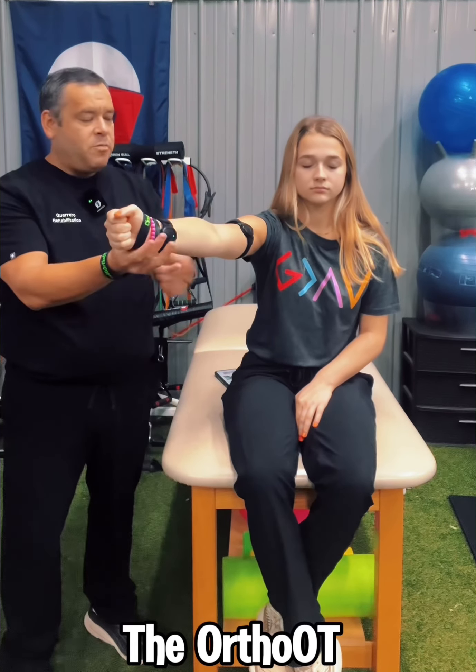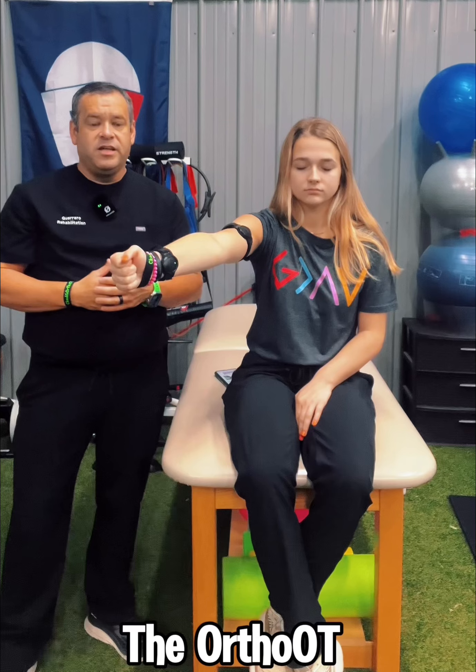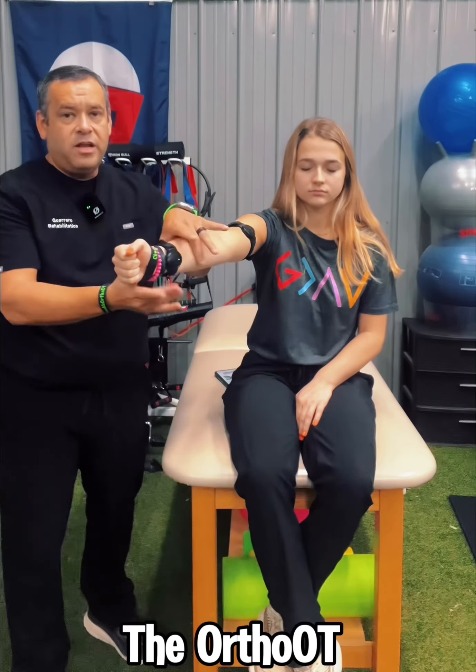Now I'm going to have her close her eyes. I'm going to bring it right back out to that same spot. She's going to hold it while I try to move her around a little bit. Perfect. I'm going to bring it back down and, with her eyes still closed, I want her to bring her arm back to the exact spot I had it. Then I'm going to go back in and do those perturbations again, and then just relax.